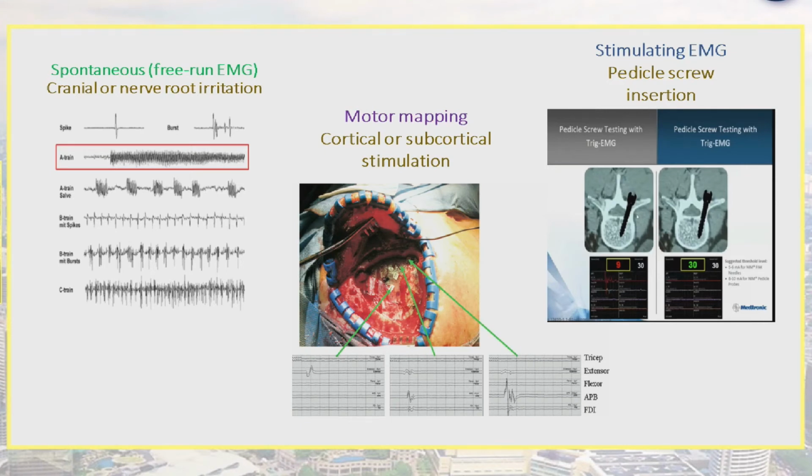And we use it in motor mapping, whereby we put a probe, we stimulate, and we see the stimulation either visually or audibly.